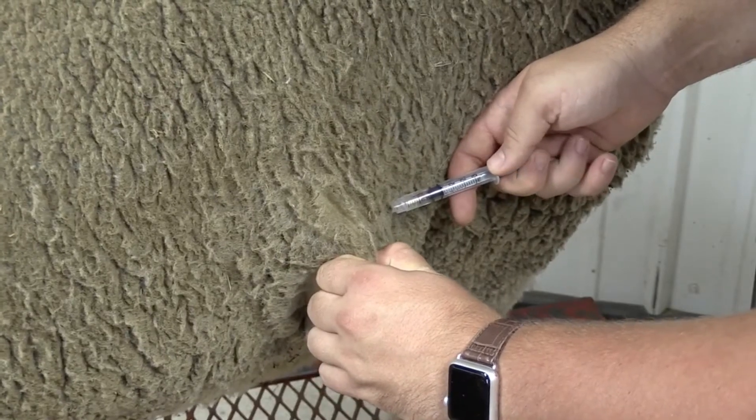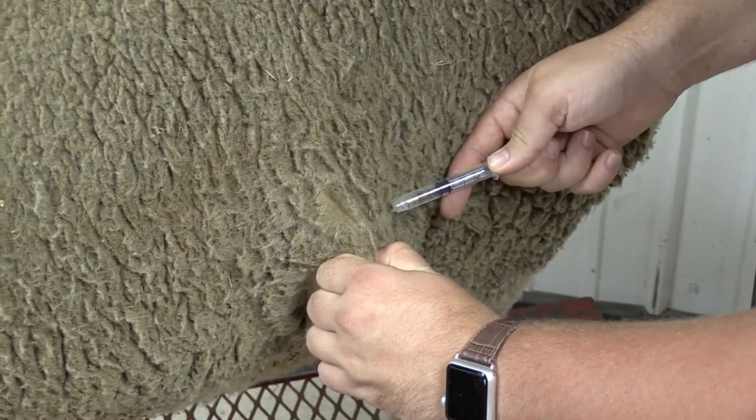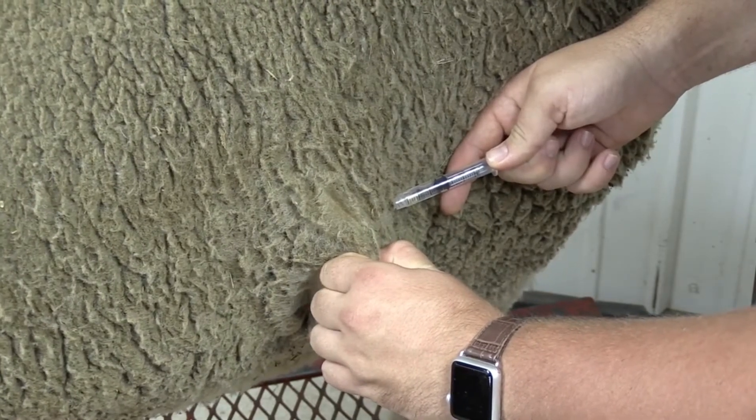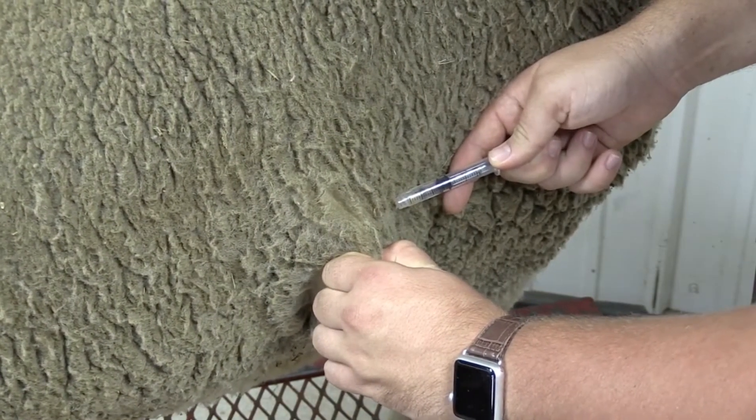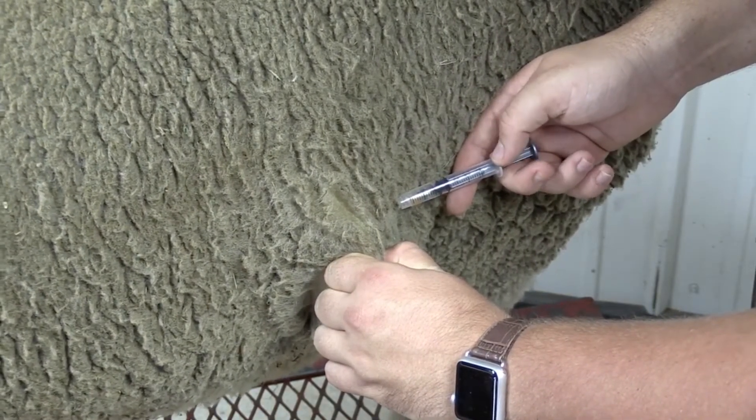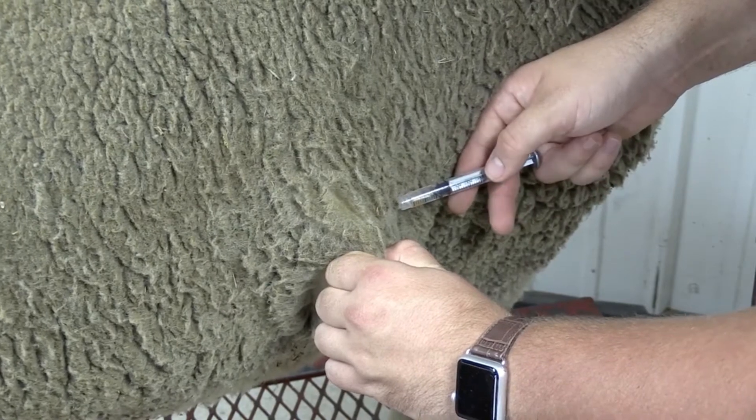Once the needle's in, we'll slowly aspirate the needle, which means to pull back on the plunger, which allows us to see if we've hit any blood. If we have hit blood, we'll slowly have to take out the needle and try a new location. Since we haven't here, we can inject.